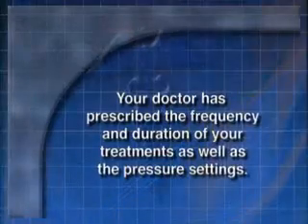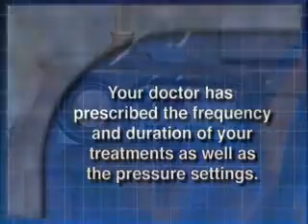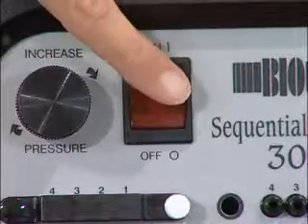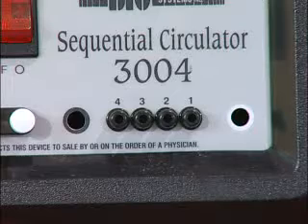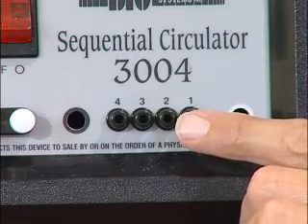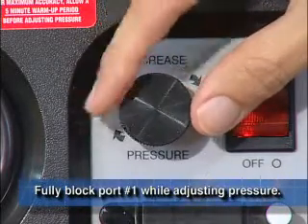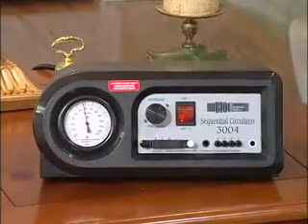Your doctor has prescribed the frequency and duration of your treatments along with the pump pressure settings to be used. Should you need to set or change the pressure settings, do so with the sleeve disconnected from the base unit and proceed as follows. Flip the switch up to the on position and let the pump run for approximately 5 minutes. Afterwards, place your finger over the air supply, port number 1, which is located to the far right. Partially covering the port, wait until you feel air start to come out. As soon as air is felt, fully block the port with your finger while turning the black pressure control knob on the front of the base unit, and while observing the gauge, set it to the desired pressure.